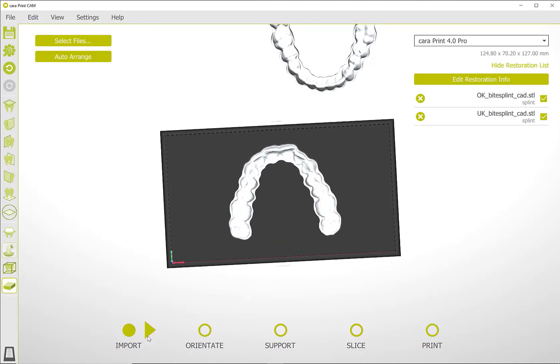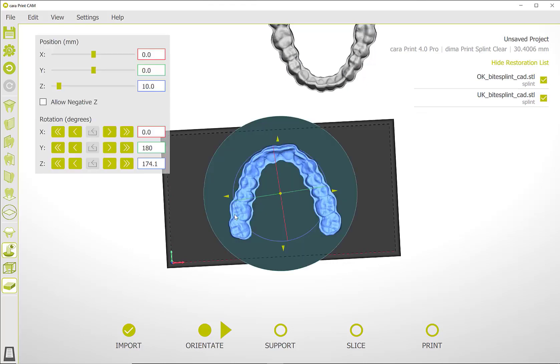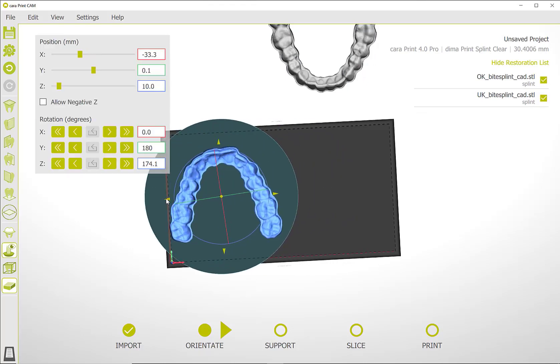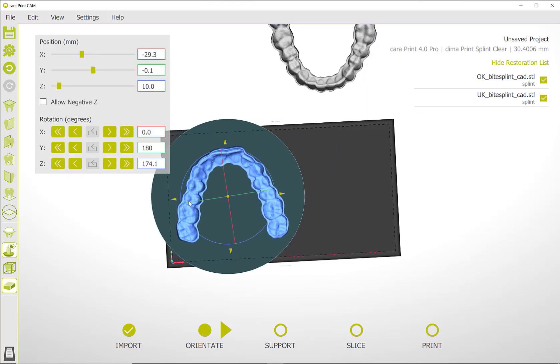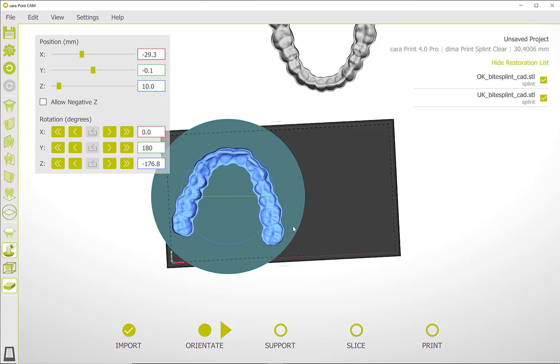In the next step, orientation, position the objects to be printed so that they are all positioned without contact to each other in the area of the build platform.